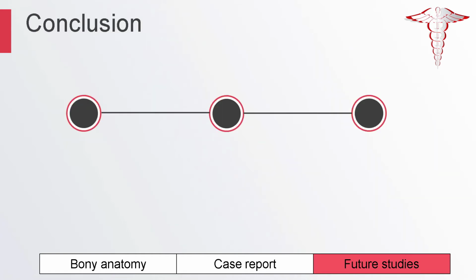That's one slide. So in conclusion, right now, most people don't really do dynamic X-rays. And so, should the standing X-ray still be done? I think so. I think it's too good of an opportunity to pass to do an X-ray, say, at the time of injury. And it's already a difficult thing to manage. Why make it more difficult? We need to know what's going on, and any information is good information.